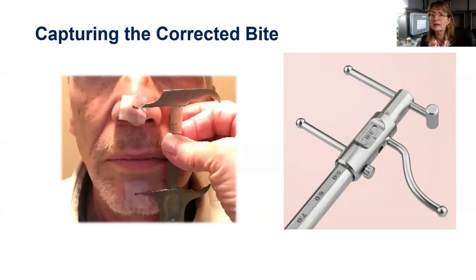So talking about measurements and so forth. We've got a Boley gauge here to the left-hand side. I'm sure all of you, if you're not currently using it, remember it from dental school. And then this little gizmo to the right is a, see if I pronounce it correctly, Cometior. There's a couple different brands out there. Look on social media.